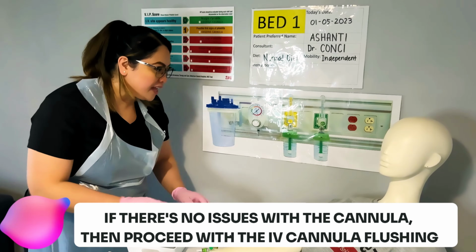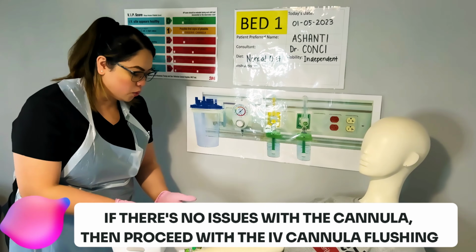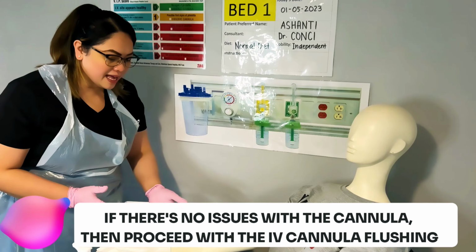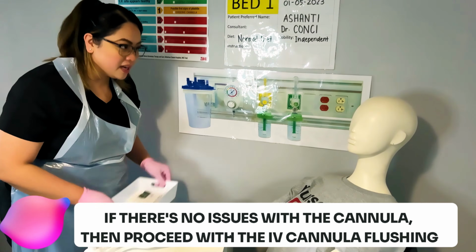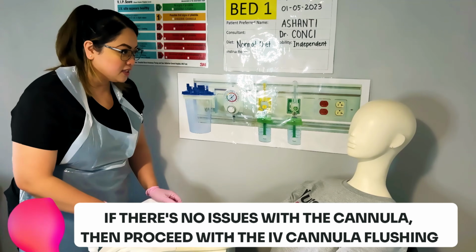So, how's your new cannula at the moment? How does it feel? Are you alright? Are you comfortable? Is it now okay? Yeah, it's okay. Alright, so now I can confirm that the IV cannula is resited, so I'm going to give you the IV flush, okay, of sodium chloride pre-filled syringe, okay?